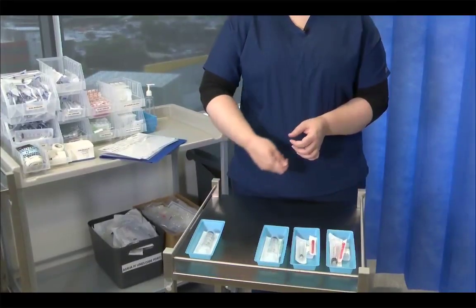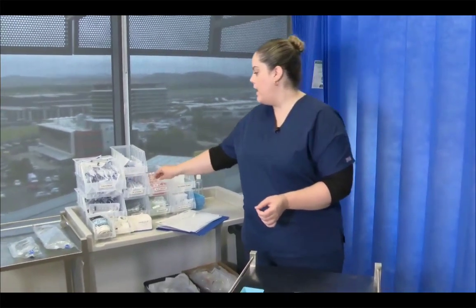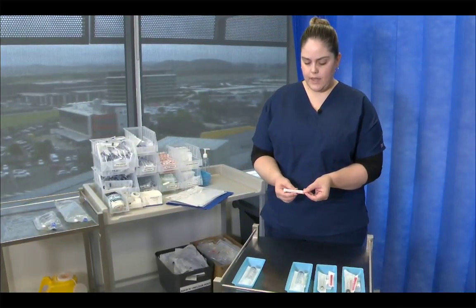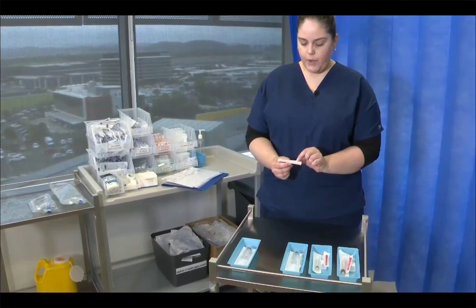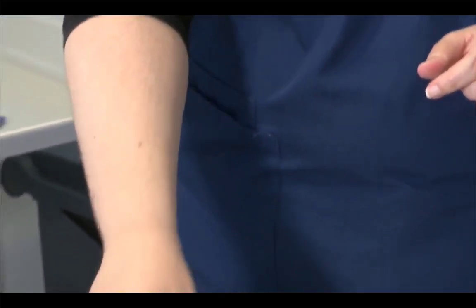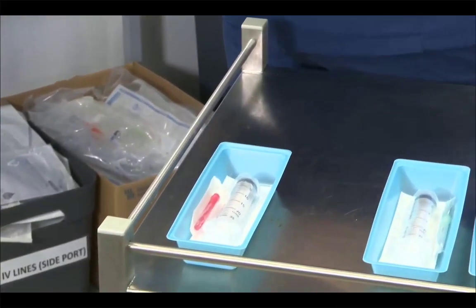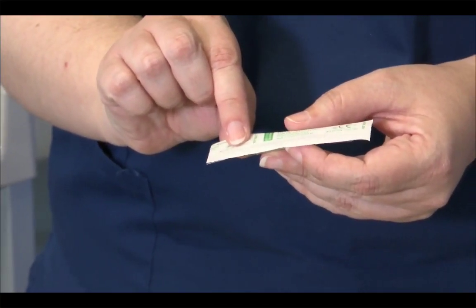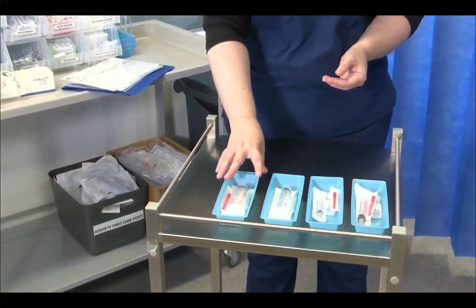This one is for drawing my S8 medication up as well as injecting it into the bag. So I'm going to need a red needle and a green needle. A red needle for drawing the medication up and a green needle for injecting the medication in. So again, I have a red needle, checking the expiry is 2027, and that's a blunt beveled needle, and a green sharp needle, checking the expiry is 2028, and that is going in for that section.